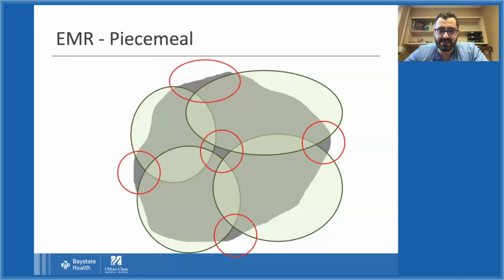Sometimes those areas, most of the time, if I see them, I can keep cutting, okay? But sometimes they can be difficult to see. Remember, when we start cutting, patients might bleed, the shape of the polyp will change, so it can be difficult to see.